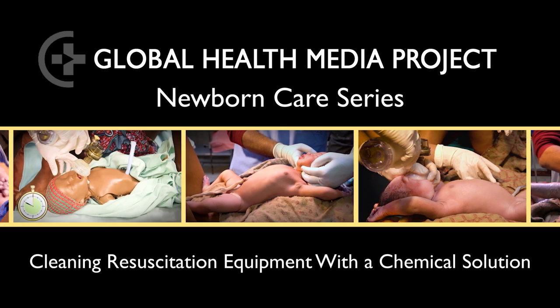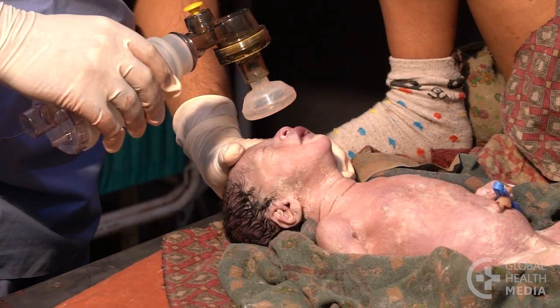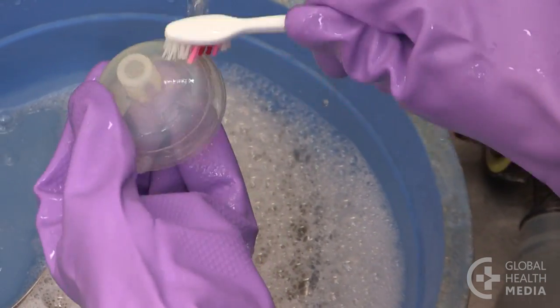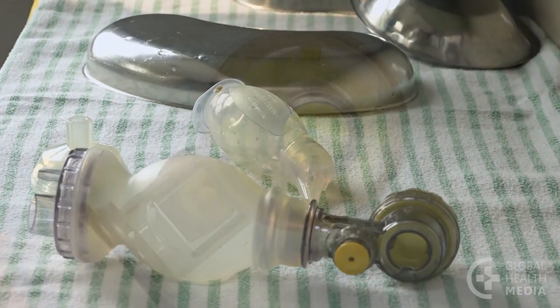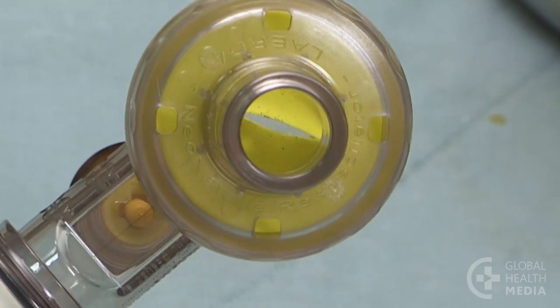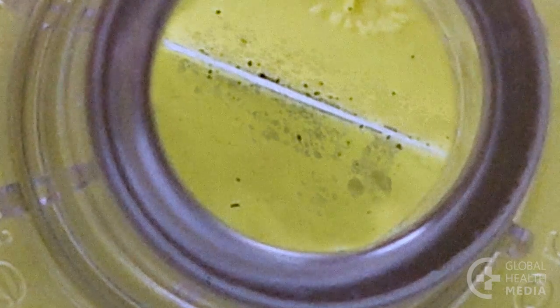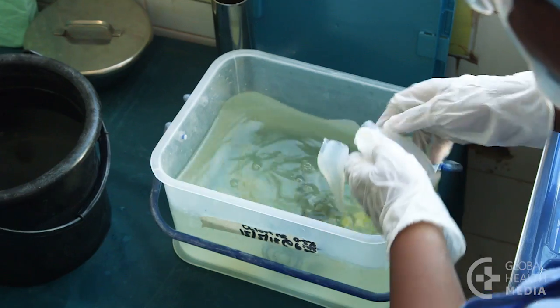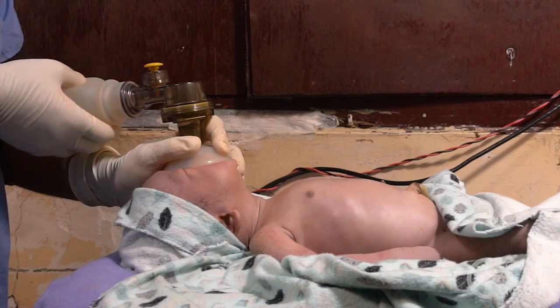Cleaning resuscitation equipment with a chemical solution. During use, resuscitation equipment becomes contaminated with the body fluids of mother and baby. If you simply wash your equipment with soapy water and set it to dry, the equipment may appear clean. Harmful germs, too small to see, may still remain. These germs can pass into a baby's airway, leading to infection. This video will show the key steps of cleaning resuscitation equipment, including using a chemical solution to disinfect the equipment. This will make it safe for the next baby.